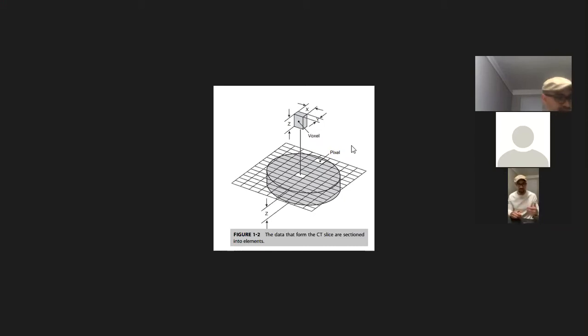Now, Savannah, I know we've had some discussions about this, but Leah, if this isn't clear, then just make sure you chime in, okay? So high contrast resolution or spatial resolution is one thing, and then low contrast resolution. If we talk about that, we're saying just contrast resolution. So those are the same things, all right? So just make sure it's clear. And we're going to use the term spatial and then just contrast resolution, okay?